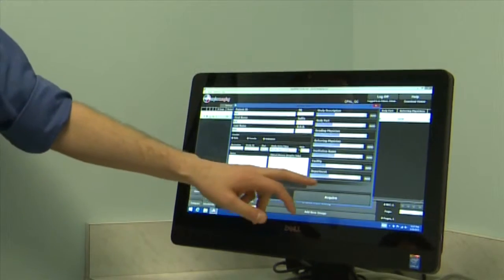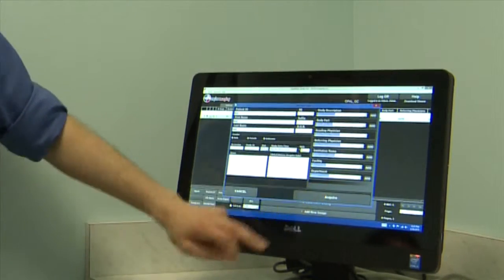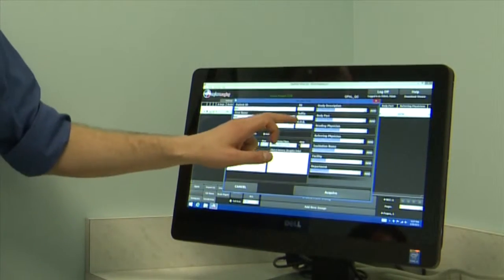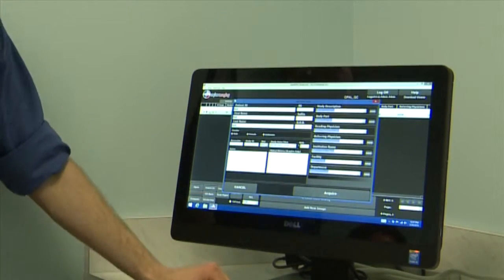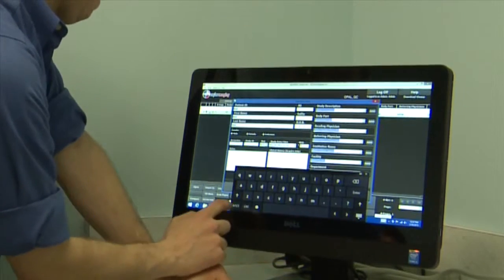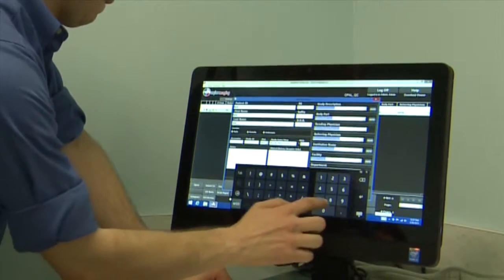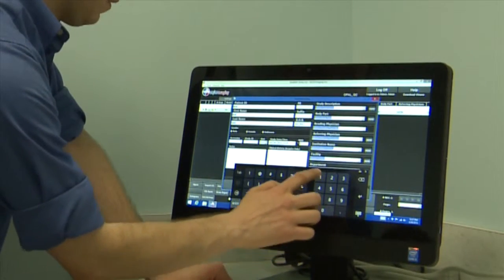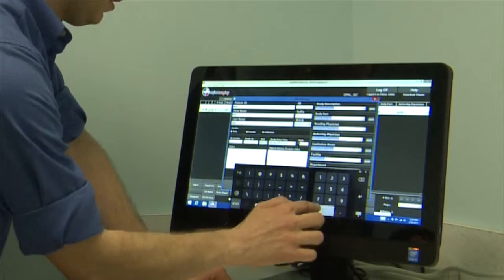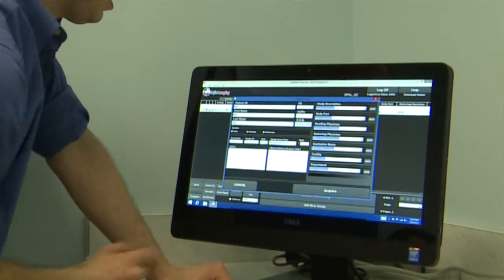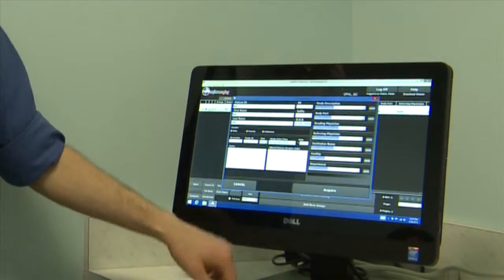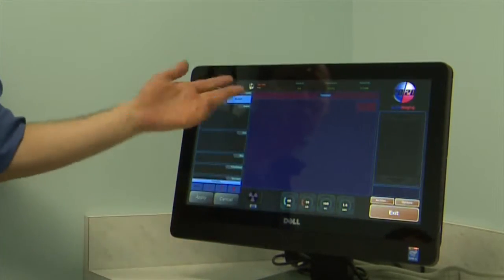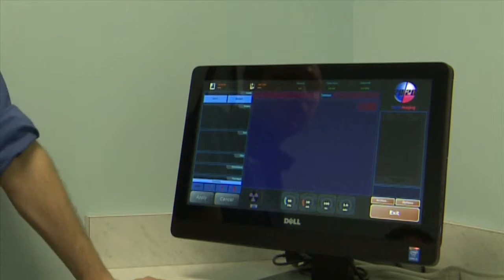After you've filled in the patient information, click the Acquire button. It won't let you proceed until you've completed all required steps, like date of birth. Clicking Acquire brings you to the acquisition software.